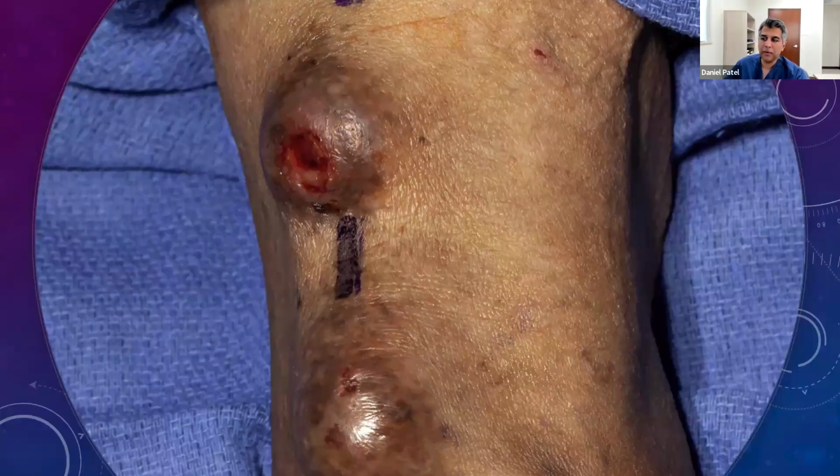And this is what we want to avoid, when we have ulcerations here. When the skin starts to get shiny, that's when it's starting to get thin. When we start to see scabs and things like that, this is a result of sticking the same areas over and over. Again, those might be the only sites that we can cannulate, and there's no other choice. But ideally, we do a rope ladder technique where we can cannulate in different spots, avoiding these areas of ulcerations. And these can be deadly.